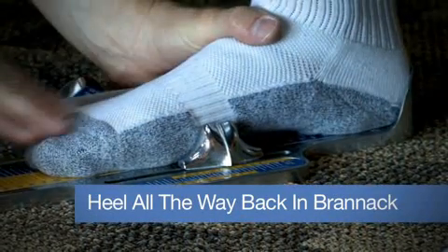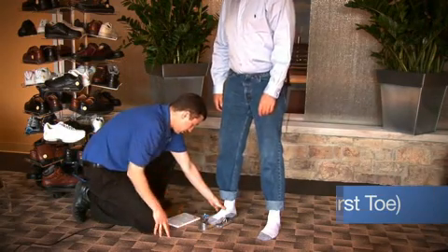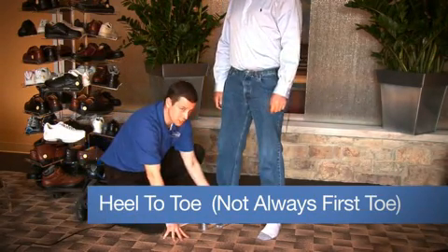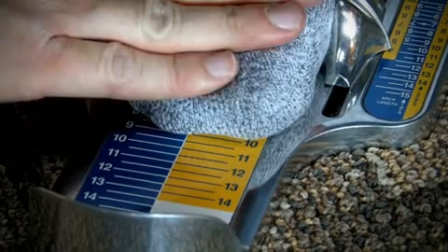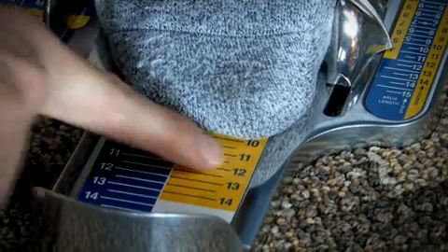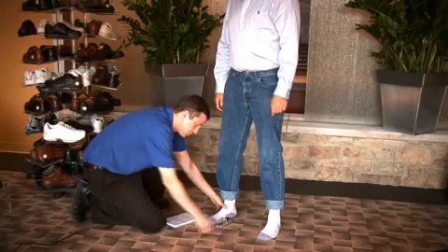Once we've done that, we check the first measurement from our shoe fitting form, which is heel to toe. Again, heel to the longest toe. It's not always the first toe. It may be the second toe. In this case, it is the first. Once I mildly press down, I notice that he's about a 9.5. So I'd write that 9.5 on my shoe fitting form.